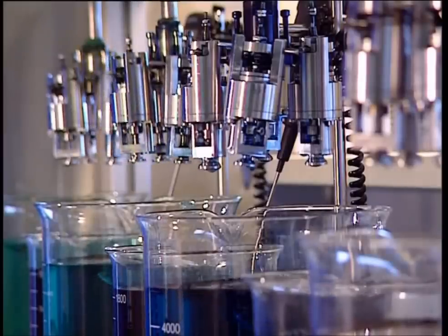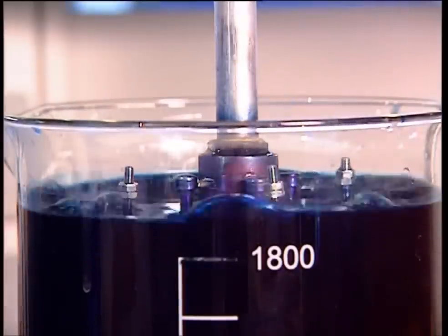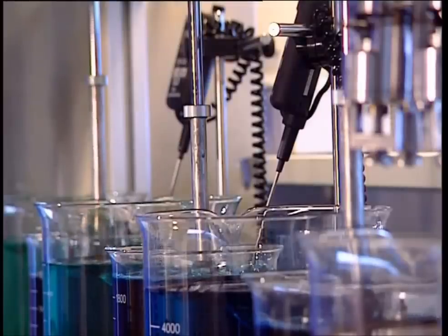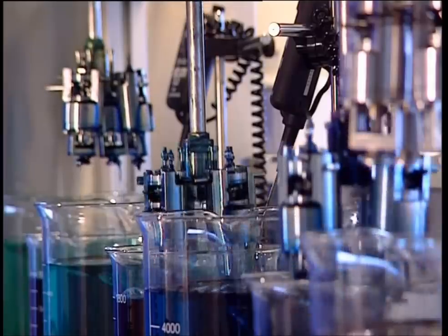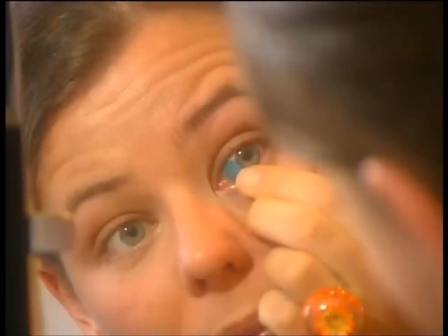The lenses are held in a brace and then dipped in dye. So instead of just choosing the color of your frames, you can now choose the color of your eyes too.